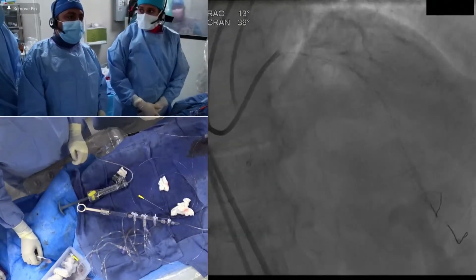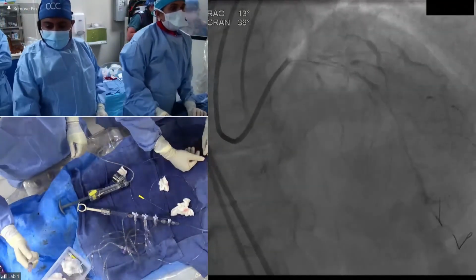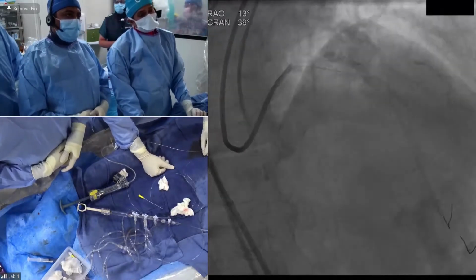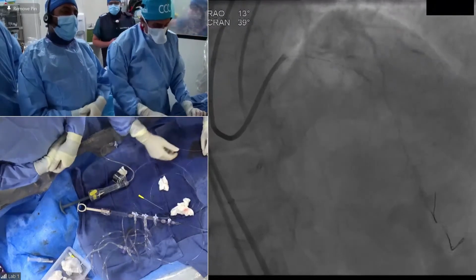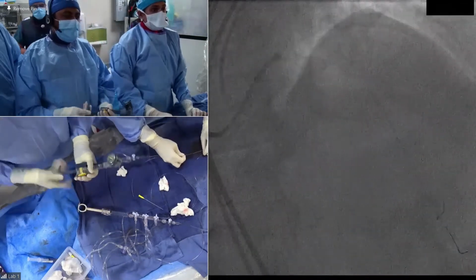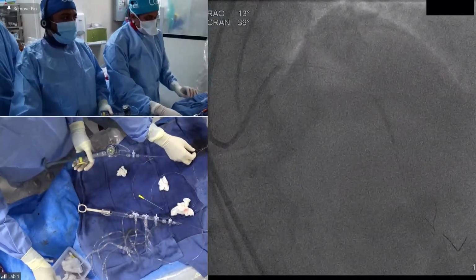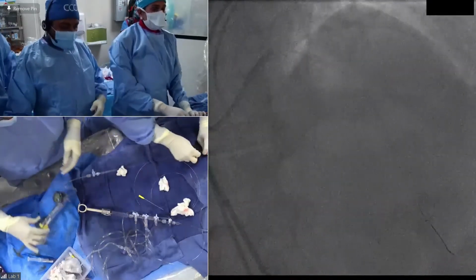3.2, 3.8, 2.75, 3.2. AK, can you comment on how you're choosing the stent size? It sounds like you need a 3.8. What will the vessel be? You want a 3.8? You see that the LAD is bridged also. Do you want to IVUS it? Are you able to recognize the bridge in the LAD? Well, we have to, but the bridge goes at the end of the CTO. Okay. I don't think there's a way to avoid that. So you want to put a long one? Well, you have to think about the surgeon. He may need to come and graft it one day, so maybe you don't want to put the stent. Yes, that is why I didn't want to put a long stent. Exactly.